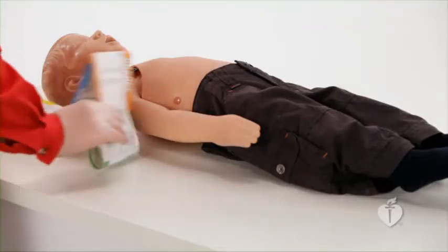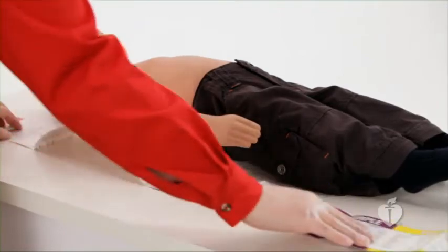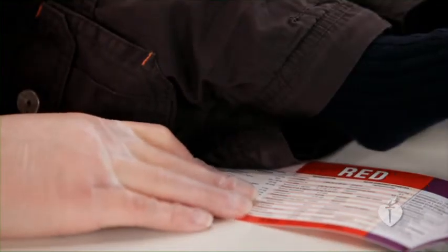The technique of endotracheal intubation, when performed by properly trained providers, allows reliable oxygen delivery to the lungs with less risk for gastric distension. Special care and expertise are necessary to maintain cervical spine motion restriction during intubation if spinal trauma is suspected. Proper endotracheal tube and other equipment sizes and medication doses are often best estimated with a color-coded length-based tape. Measure from the top of the head to the heel.